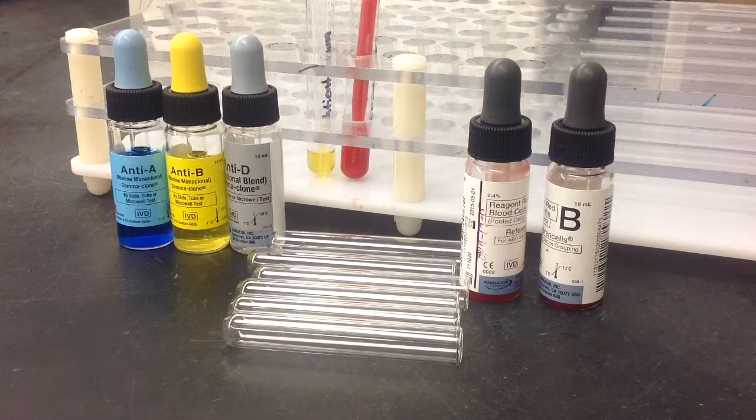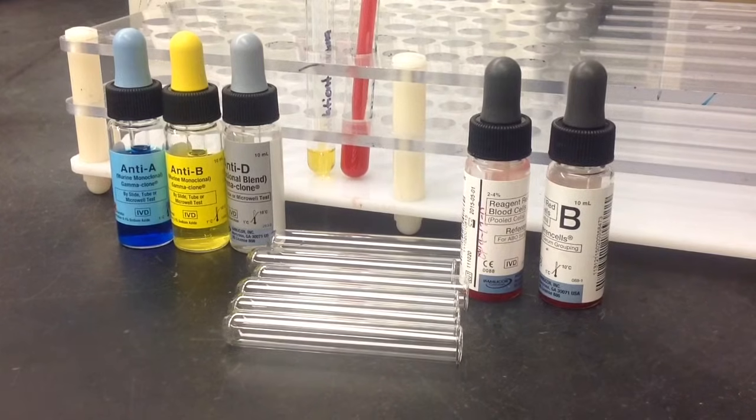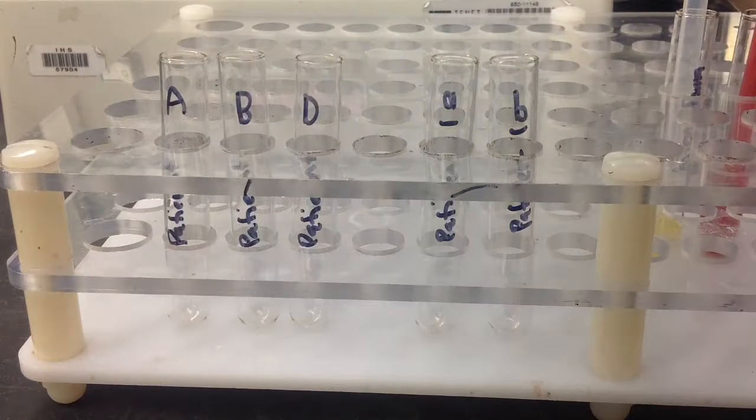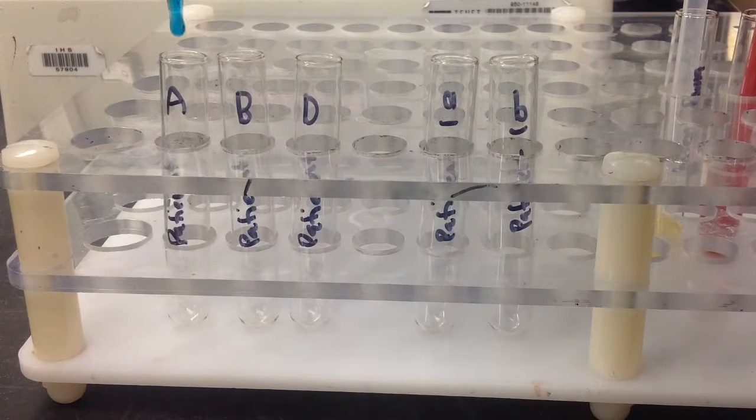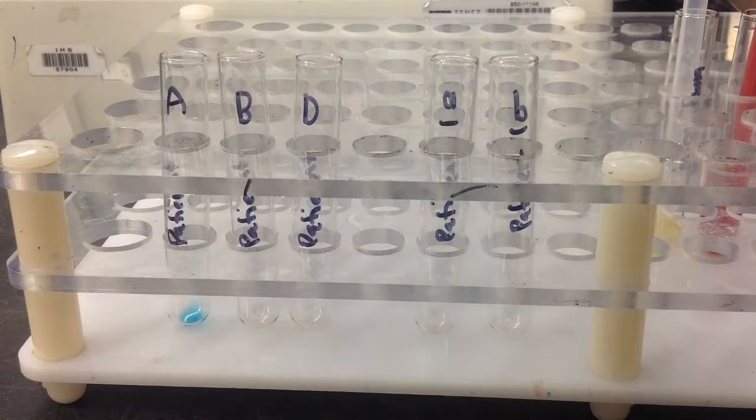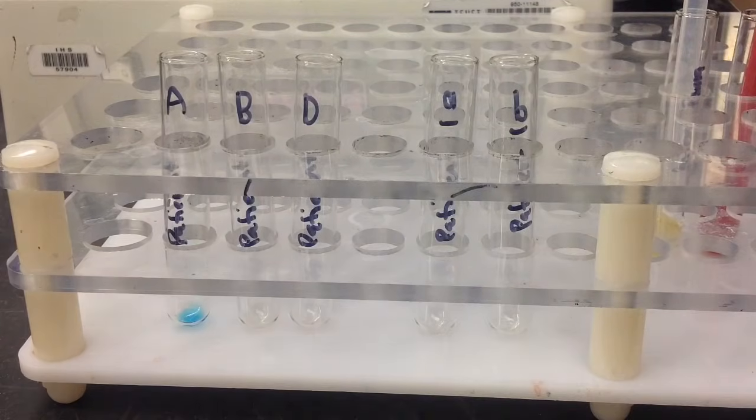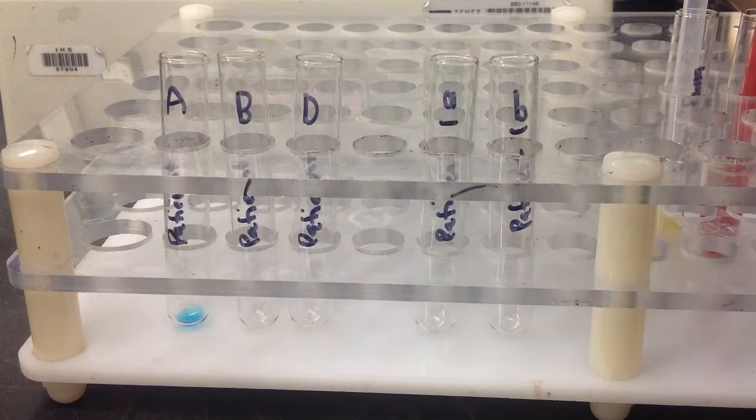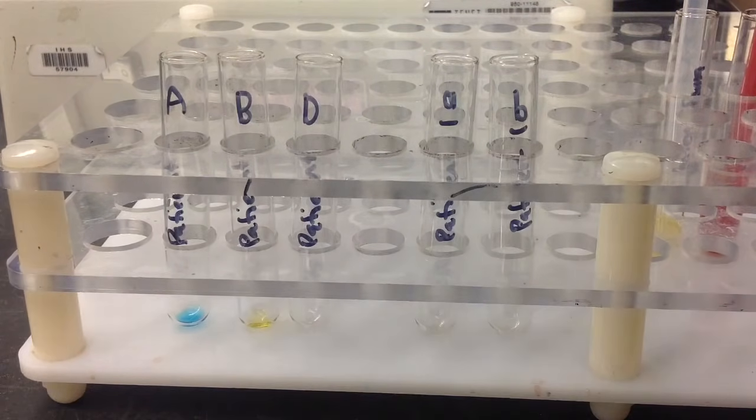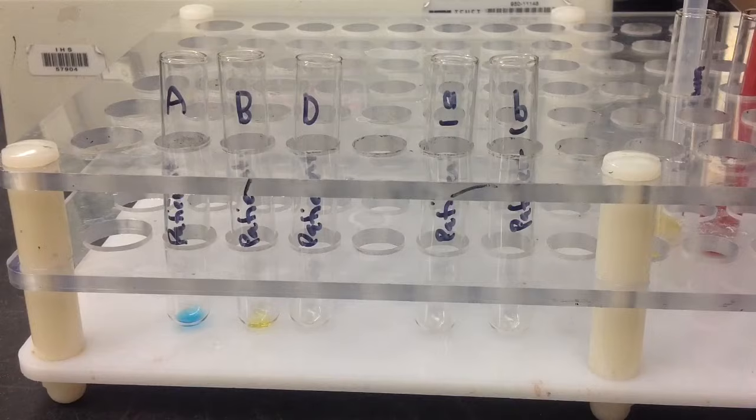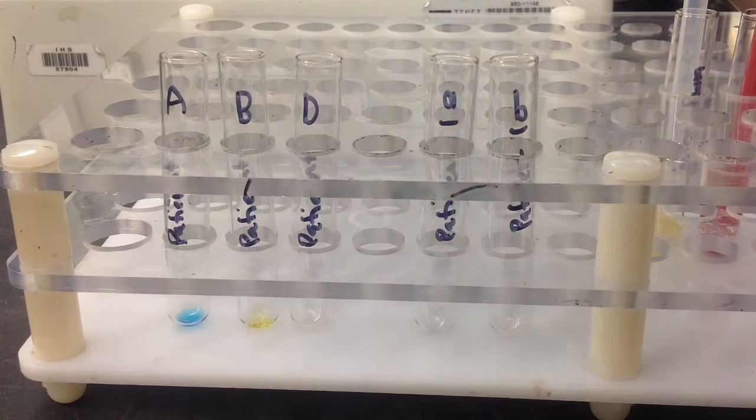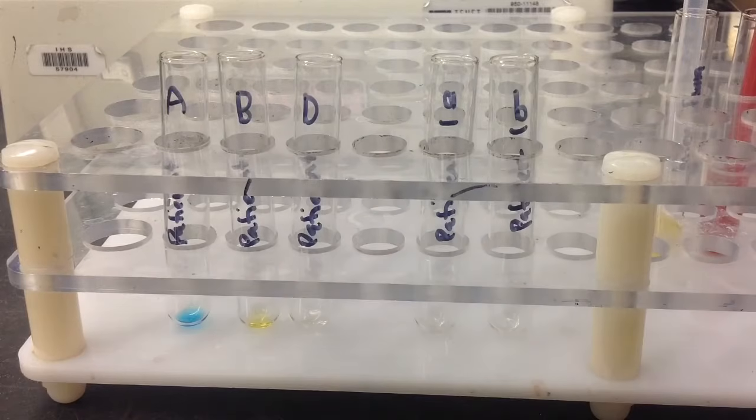Alright, once you have all your stuff together, you can go ahead and start to label all of your tubes. And then from there, we're going to start with the forward. We're going to add 1 drop of all of these reagents. So 1 drop of each anti-sera into the appropriate tube, so that was the A. Then you add the anti-B. And then lastly for the forward is the anti-D anti-sera. Remember, just 1 drop for each of these.